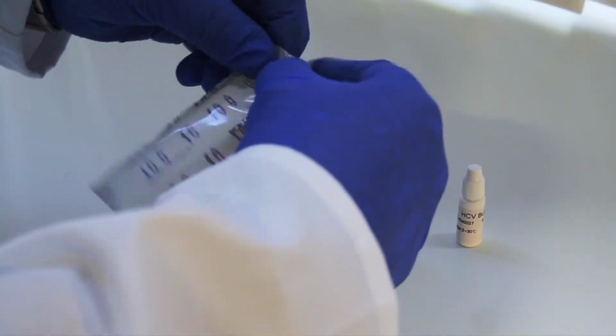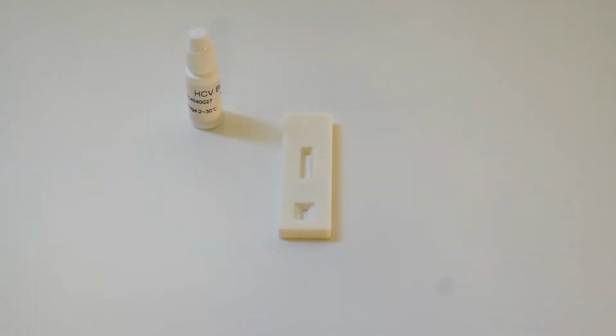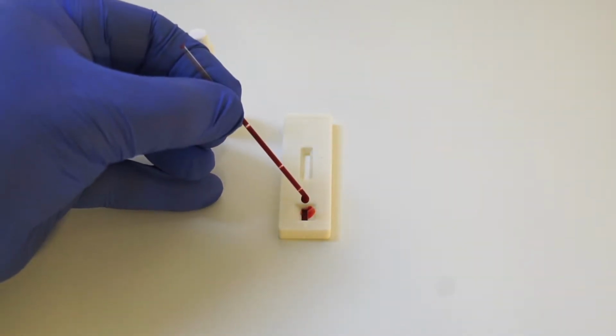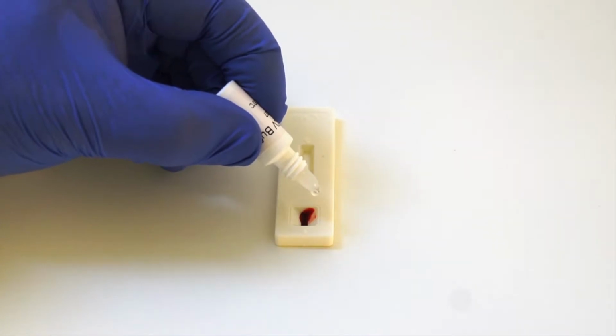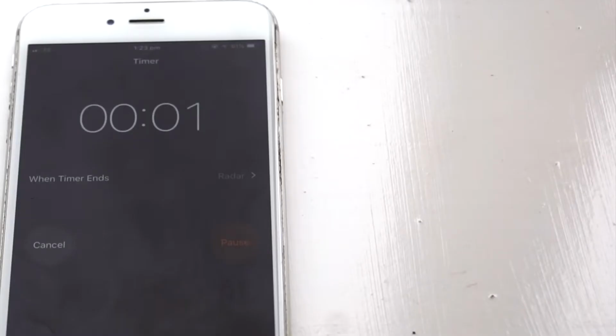To begin the test, remove the test cassette from its pouch and place it flat onto a clean and clear surface. Add 2 drops, or approximately 100 microliters of blood sample, into the sample well of the test cassette. Then add 2 drops of buffer. Read the results 15 minutes after the addition of the sample. Please do not interpret the results after more than 20 minutes.